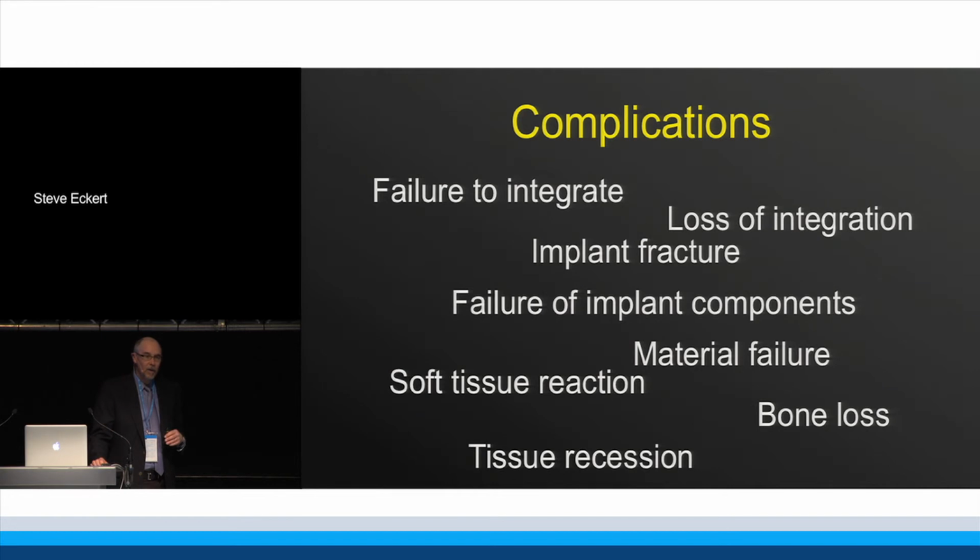Those are probably the things that we think of most when we're thinking about implants, because fortunately we're looking at a solution that works 95, 96, 97% of the time, in my practice at least.